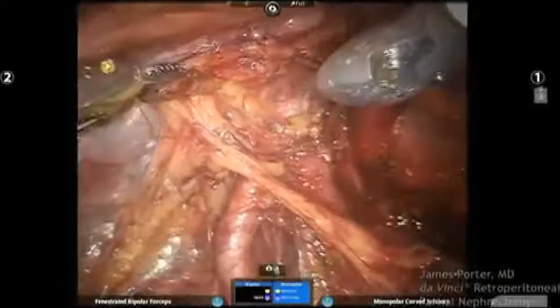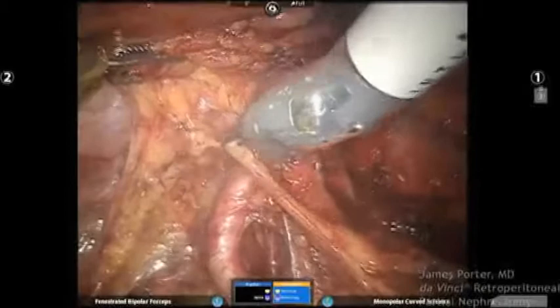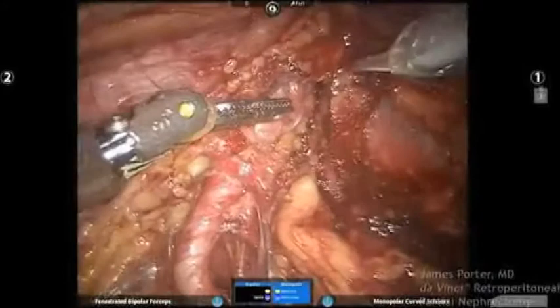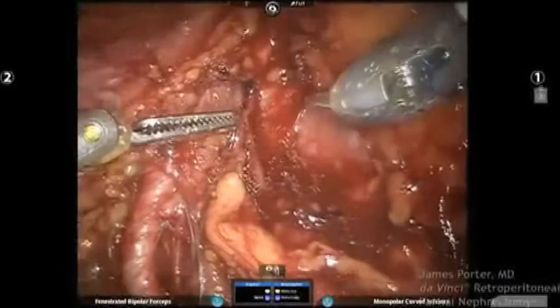We have Dr. Liming Su who's joined us here now. What about you, Lee? Do you have a preference? Yeah, I'm not sure what was discussed before I just got in here, but I tend to clamp only artery. The ones that I'll clamp both artery and vein are the ones that are closer to the hilum, where you're definitely going to get a lot more venous back bleeding. I think for the individual starting this, though, they should be prepared to clamp both in the event of a significant venous back bleed.